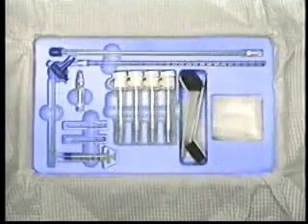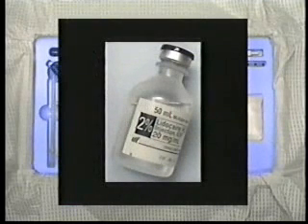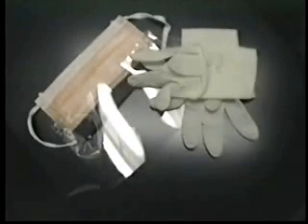Although most kits contain 1% lidocaine, we recommend using a 2% solution. Pain is a common complaint with injection since the lidocaine stretches the skin. The smaller volume required by 2% lidocaine causes less discomfort. You will need protective equipment as required by OSHA. Don't forget a trash can.